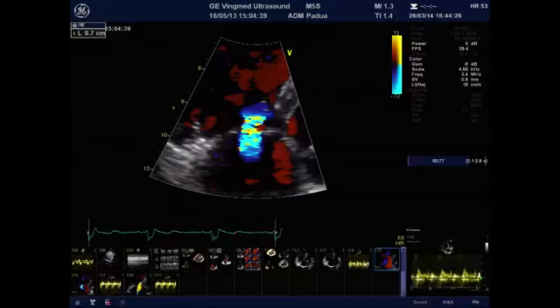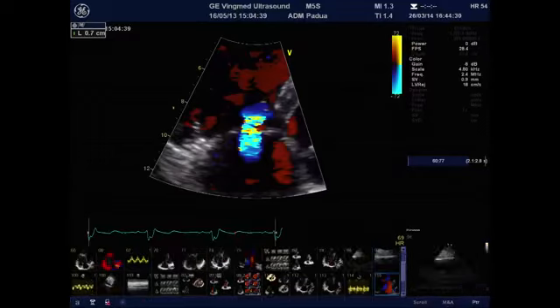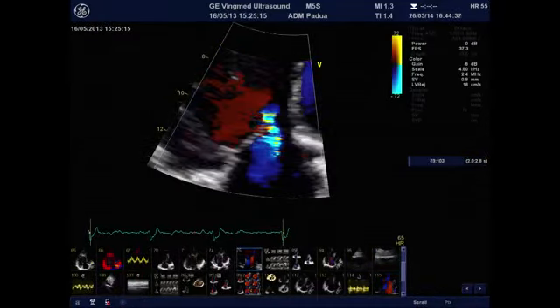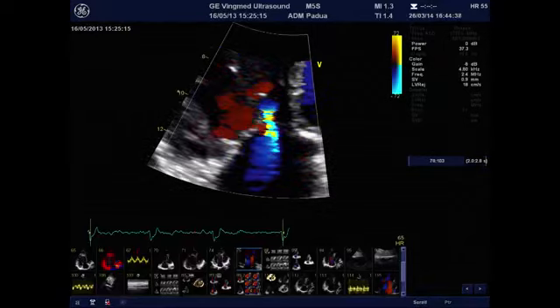However, you have seen from previous images that the jet width seemed also narrower in other views. Like in this case, if you would stop it again and measure, you would find a different number, 0.54, which stands more in the mild to moderate range.